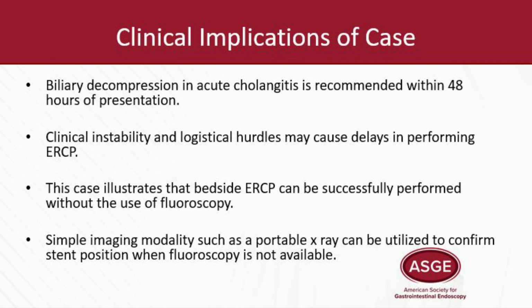Biliary decompression in acute cholangitis is recommended within 48 hours of presentation. Clinical instability and logistical hurdles may cause delays in performing ERCP. This case illustrates that bedside ERCP can be successfully performed without the use of fluoroscopy.